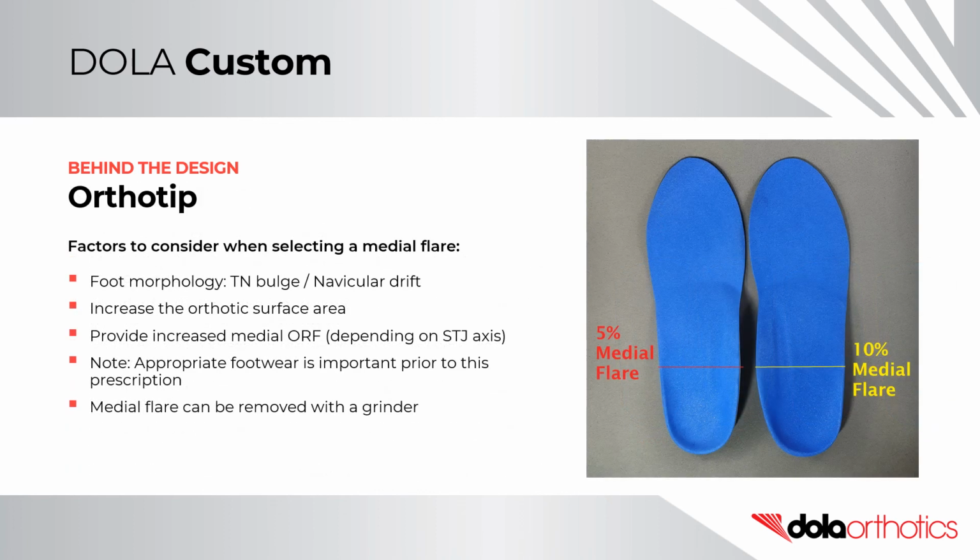Factors to consider and common uses for selecting a medial flare include: to follow significant medial foot morphology, including a talonavicular bulge or navicular drift, to increase the orthotic surface area, to provide increased medial orthotic reaction force depending on the axis location. Note: appropriate footwear is also very important when prescribing a medial flare. A medial flare can be removed with a grinder.